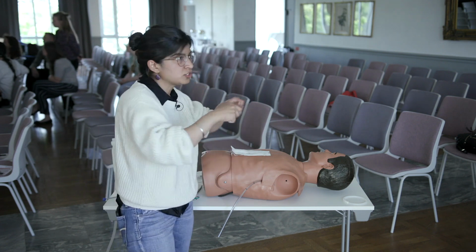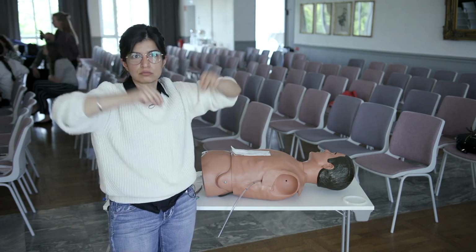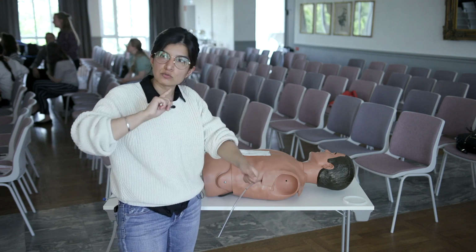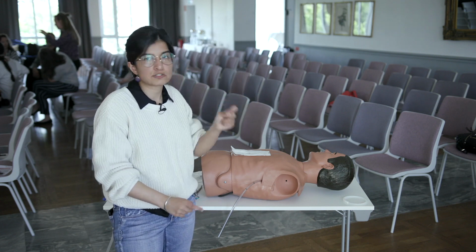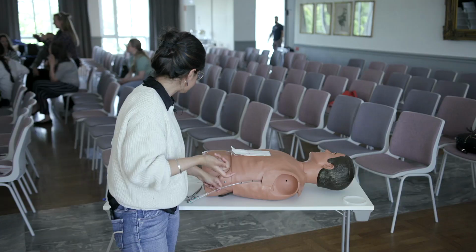Okay. So once you have an air knot, you now have two long tails. You go around the drain a couple of times, and then you tie on the drain. So this way, there's no knot on the patient's skin. And the drain is secured to your air knot, so it's not going anywhere. Make sense? Okay, so it's much more comfortable that way.